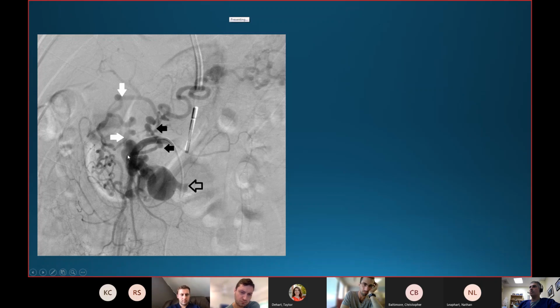pancreaticoduodenal arcades. And they have aneurysms all over the place. And she had this big pseudoaneurysm in a mesenteric branch, and that open arrow is pointing to this nipple in the pseudoaneurysm that was actually fistulizing with the duodenum. And she was getting intermittent rupture of the pseudoaneurysm into her duodenum. It was intermittently thrombosing, causing these severe bouts of hematochezia.